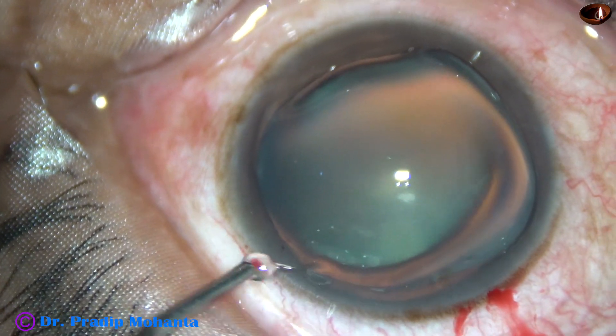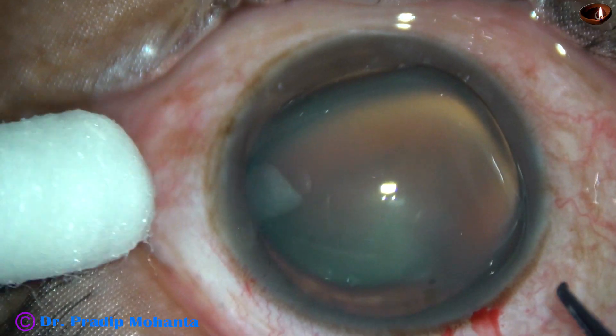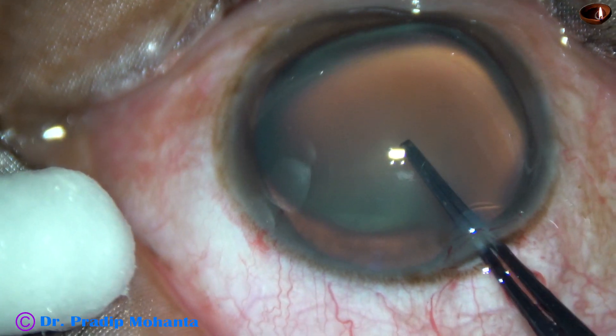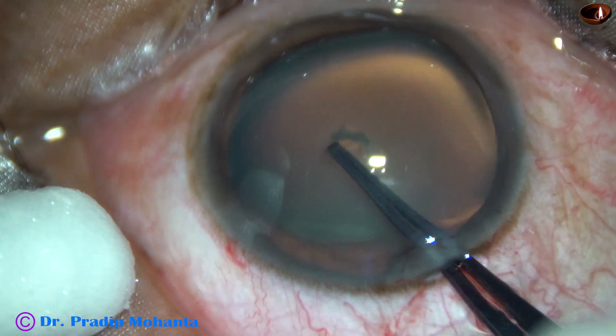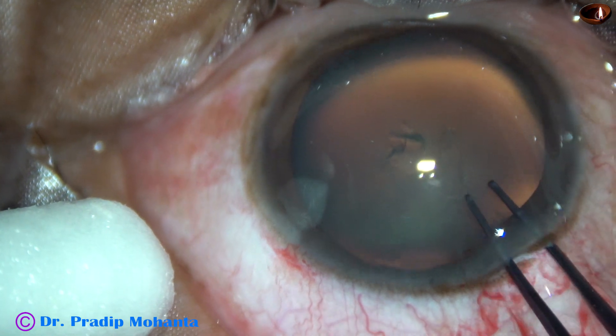The microscope being Topcon OMS 800. This is a Utrata forceps. I tear the anterior capsule, raise the tack, and go anti-clockwise.